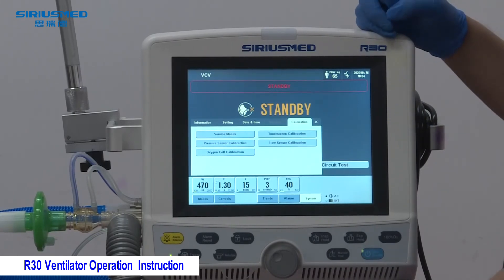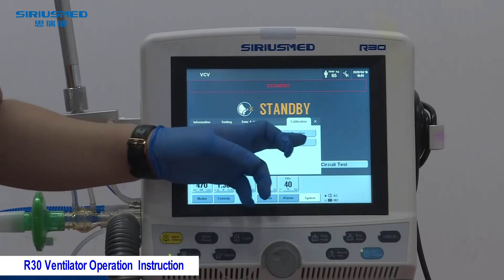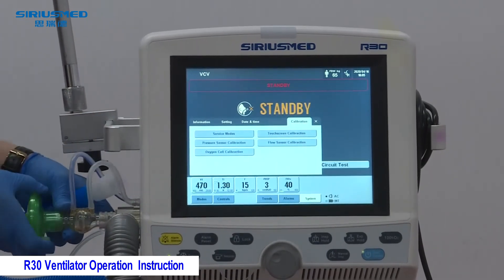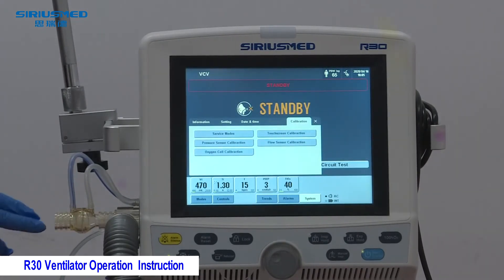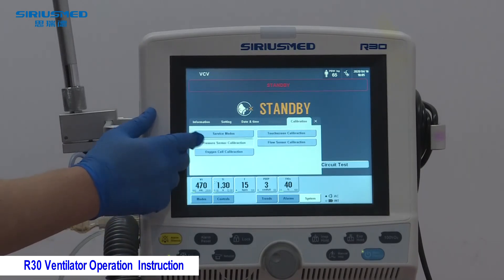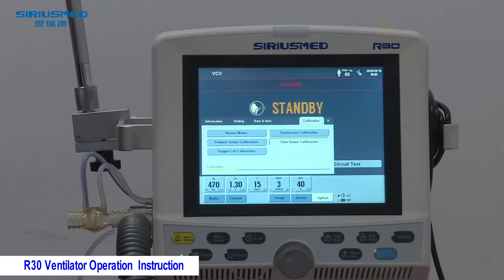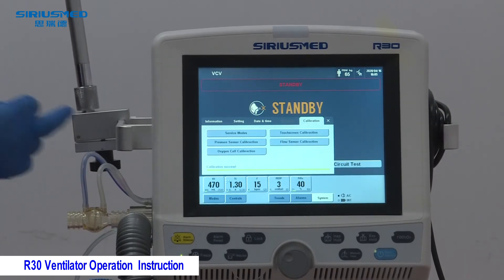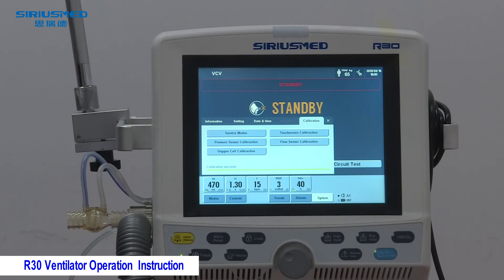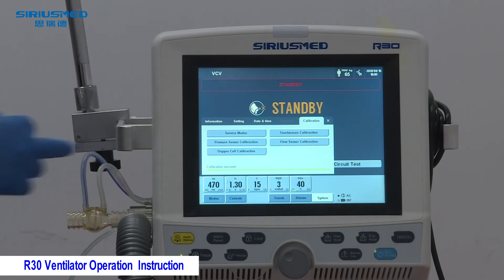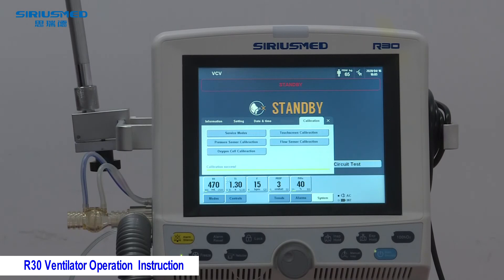The system will perform the pressure sensor and flow sensor calibration automatically. To do so, remove the tube, ensure there is no airflow directed at the sensor, and press Start — the system will calibrate by itself. For the oxygen sensor calibration, this is only required when the machine is first used, when the oxygen sensor is replaced, or when the FiO2 monitoring parameter is abnormal.